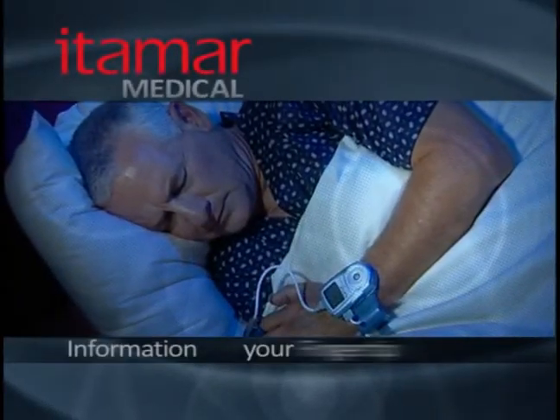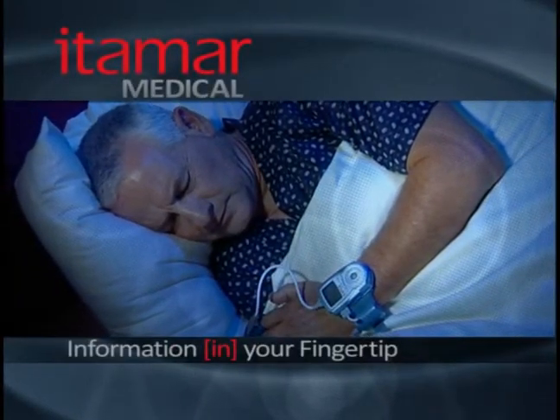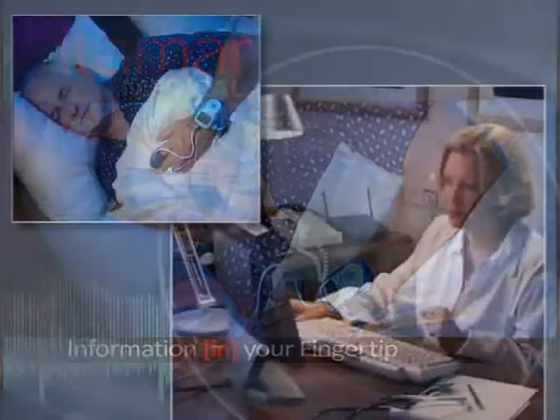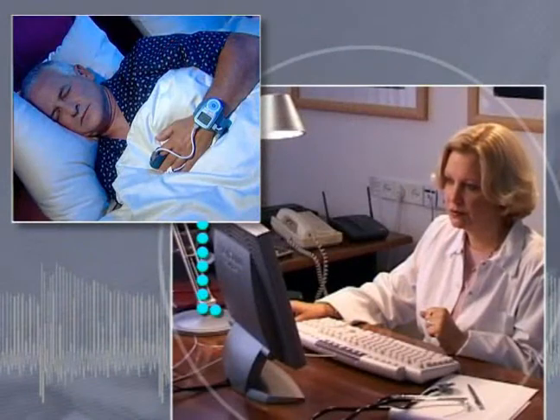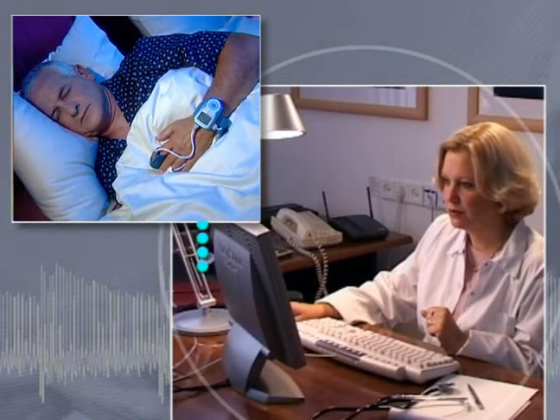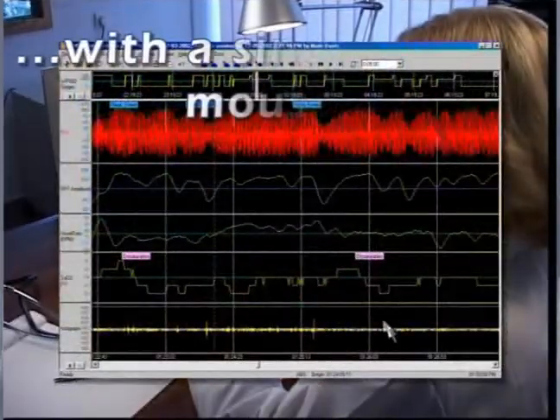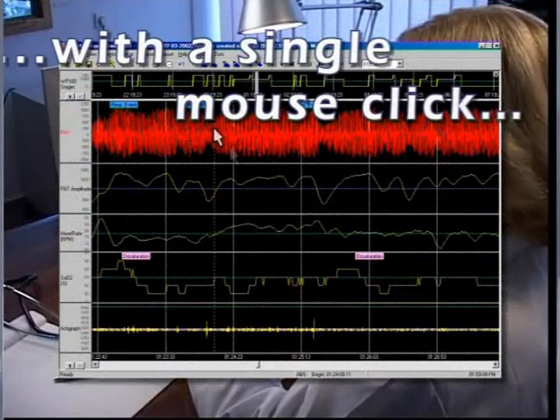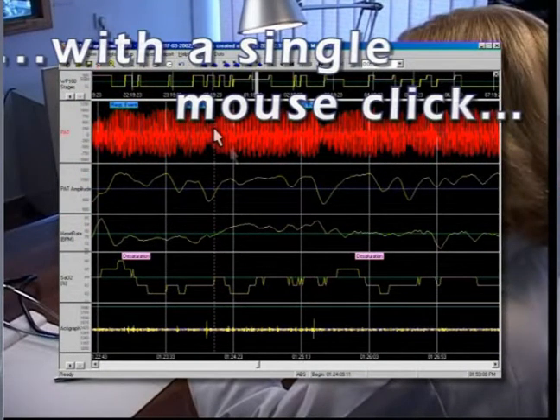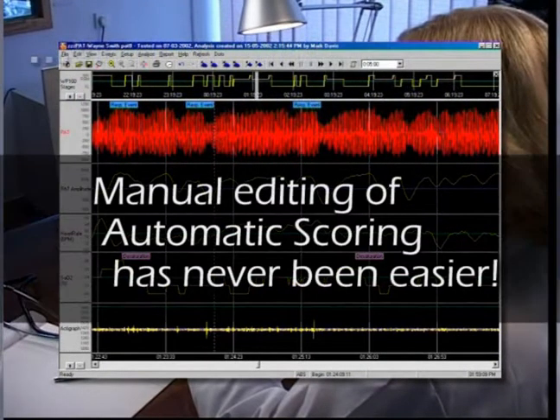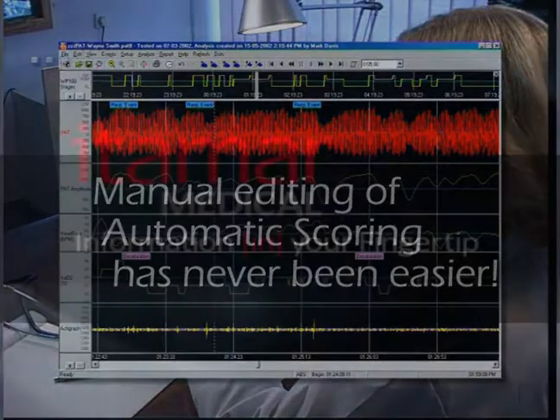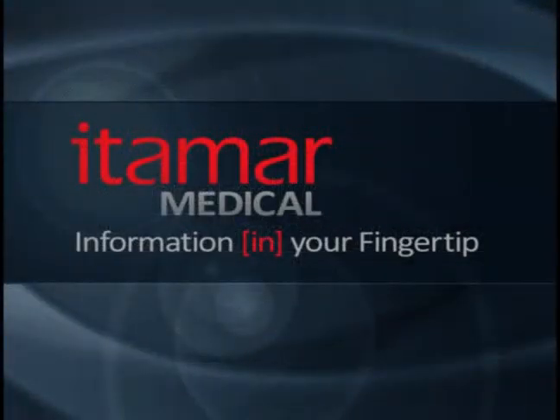So while WatchPad provides fully automatic capabilities, the interpretation can be edited according to the clinical judgment of the sleep specialist and easily modified at the click of a mouse. Manual editing of automatic scoring has never been easier.